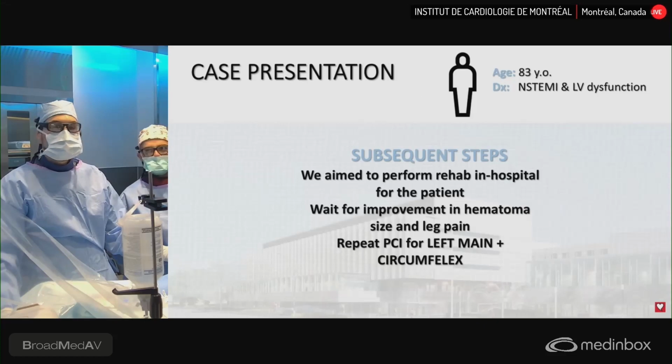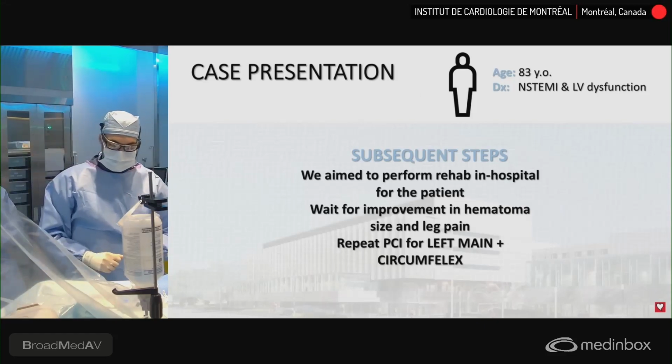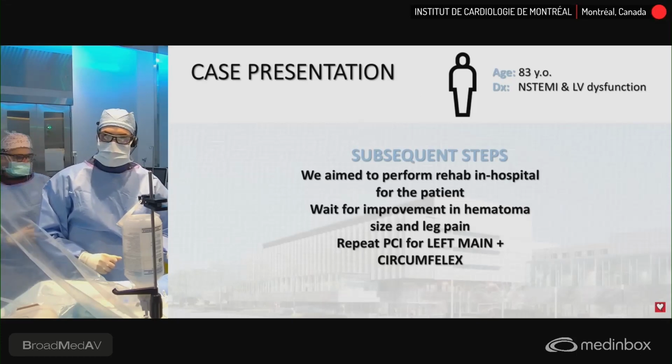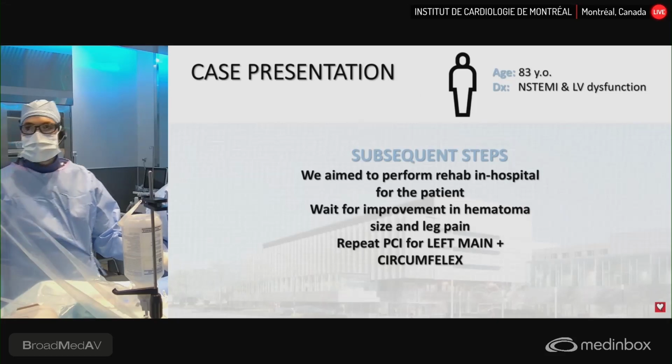So after the fact, our plan was to wait for the improvement in the hematoma and also repeat the PCI of the left main and circumflex, which we will do today.